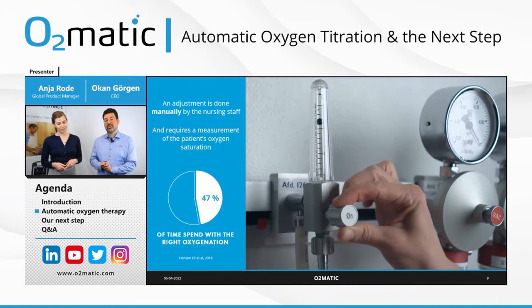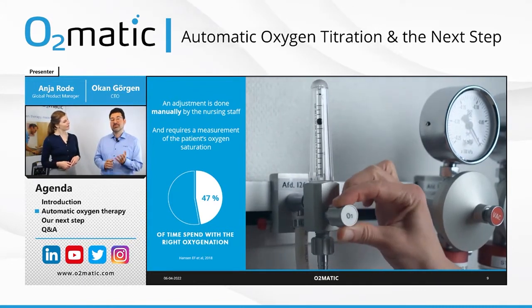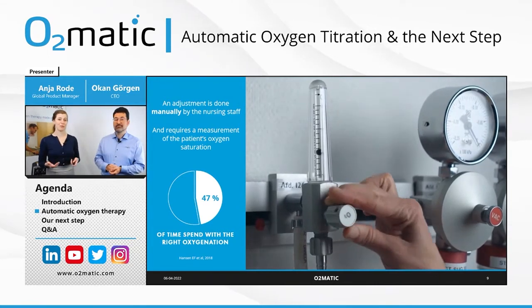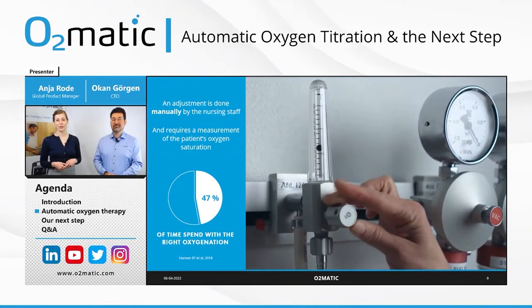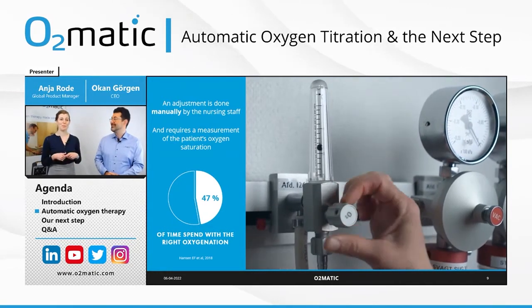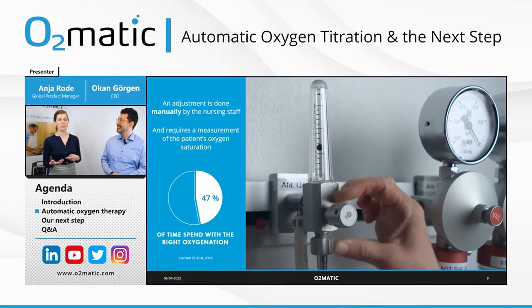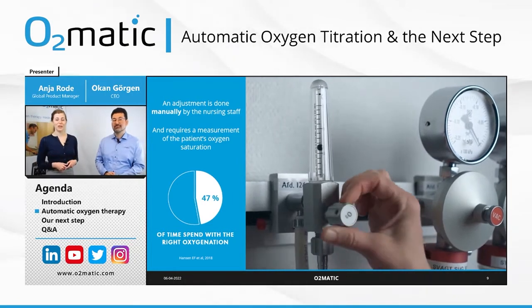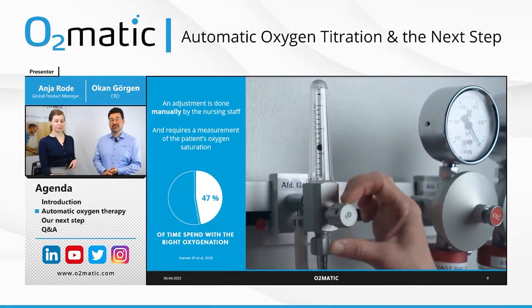I'm always looking at this and thinking, can this really be true? And just a question for you. I know you know these results very well. You have seen them before, but when you saw them the first time, were you surprised that this was the case? Yeah, I was really surprised. I guess every healthcare professional wants to do their best, and I don't think that 47% of the time is the best we can do. I don't think we would accept that with any other potent drug. We have talked about morphine as an example, but it could also be antibiotics or another life-saving treatment that we are not administering in the right amount. So this is very surprising.